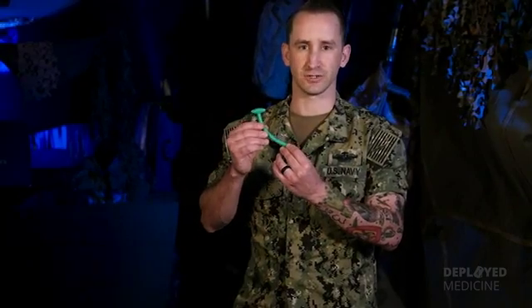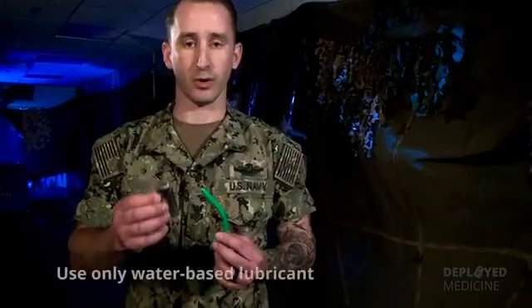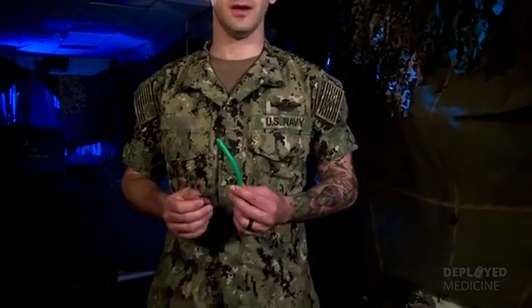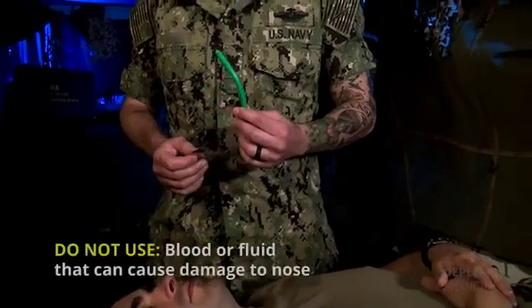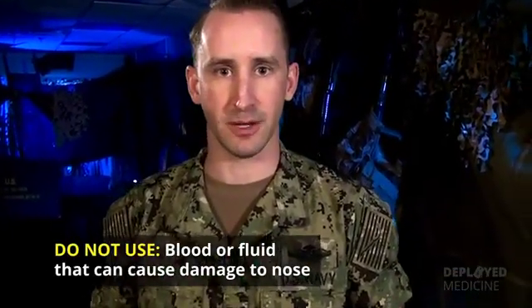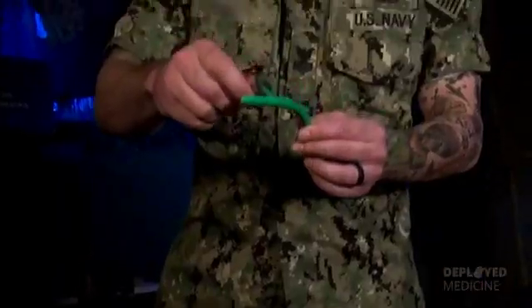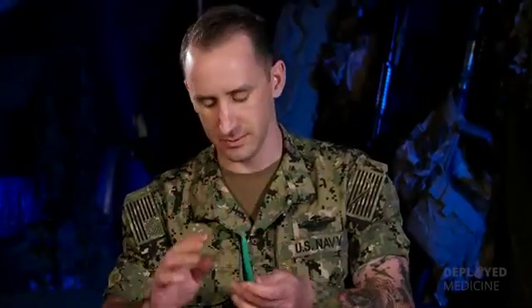This size is going to fit most adult casualties. The next step is to lubricate your NPA. Use a water-based lubricant, and if it's not available, you can use water or the patient's saliva. Do not use blood or any fluid that could cause damage to the patient's nose. Open the packet of lubricant, apply a little bit, and smear it around the tip, then get your casualty ready for insertion.